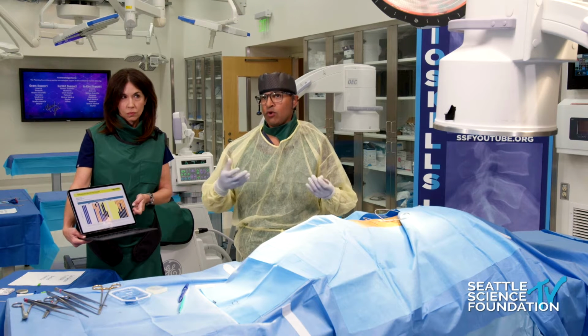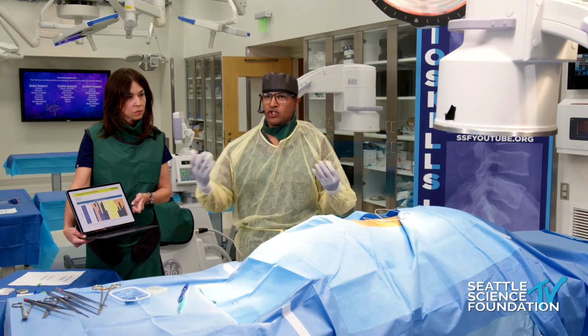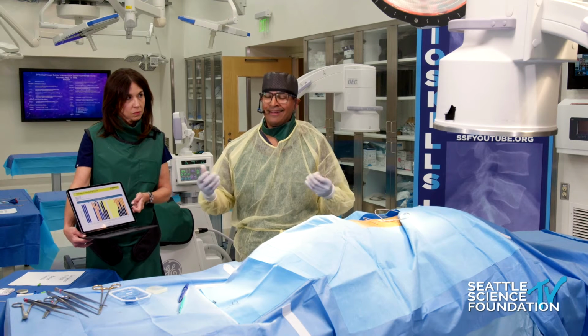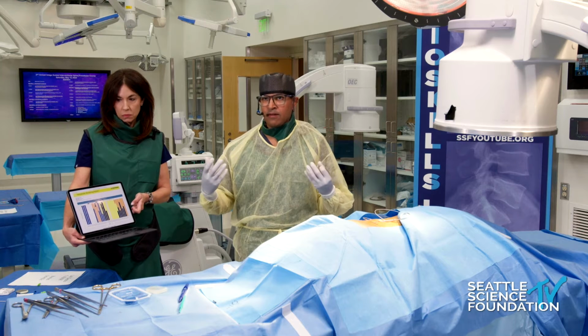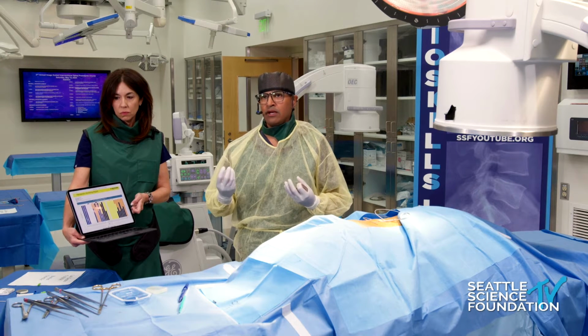Is that on purpose? If so, what are the reasons? And maybe it's just a gentle reminder to use it, turn it back on. And then that data can, of course, be uploaded to us. We can identify that as a provider and know what to do with that information.